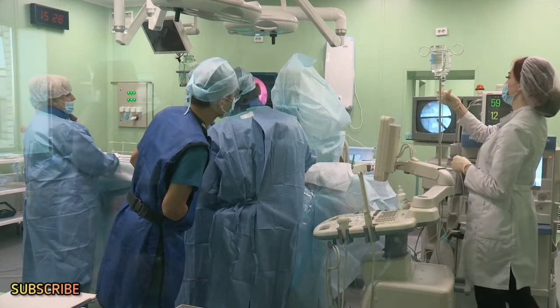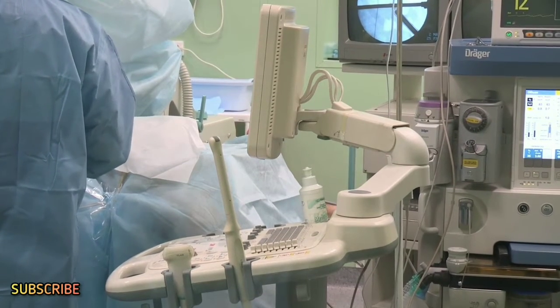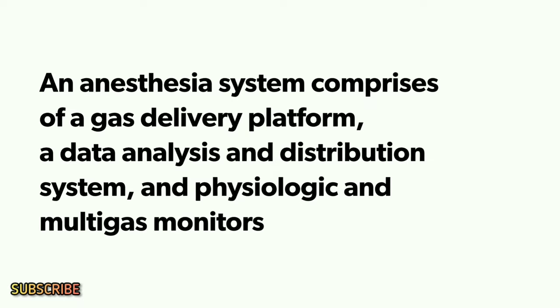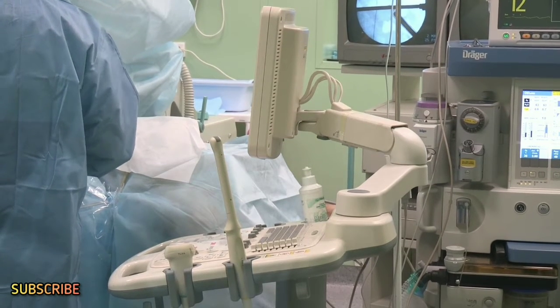Anesthesia units dispense a mixture of gases and vapors and vary the proportions to control a patient's level of consciousness or analgesia during surgical procedures. An anesthesia system comprises a gas delivery platform, a data analysis and distribution system, and physiologic and multi-gas monitors, which indicate levels and variations of several physiologic variables and parameters.